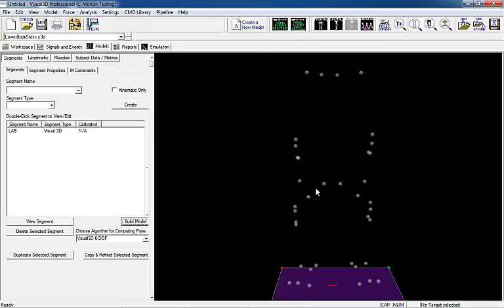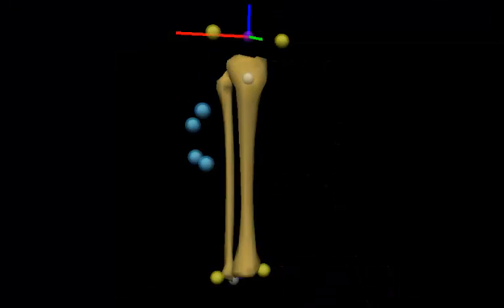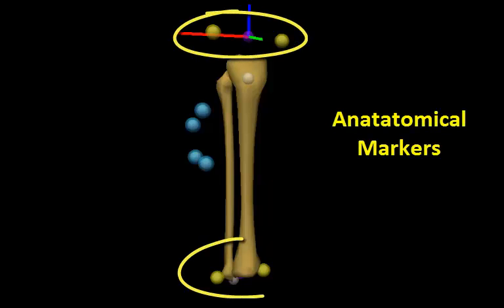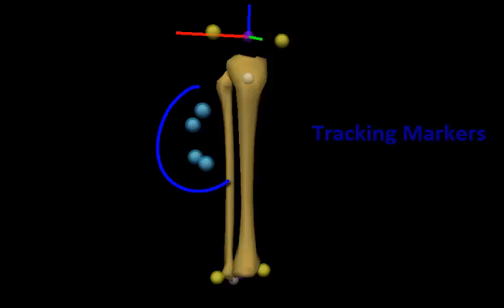When defining a model, it is important to note the difference between anatomical markers and tracking markers. Anatomical markers are placed at anatomically relevant locations such as bony landmarks near segment endpoints. These markers will be used to define the segment coordinate system. When defining the segments, they will be highlighted in yellow. Tracking markers are placed at convenient locations for tracking segments — generally locations that will not be obstructed during the subject's movement and have minimal tissue movement. When defining the segments, they will be highlighted in blue.